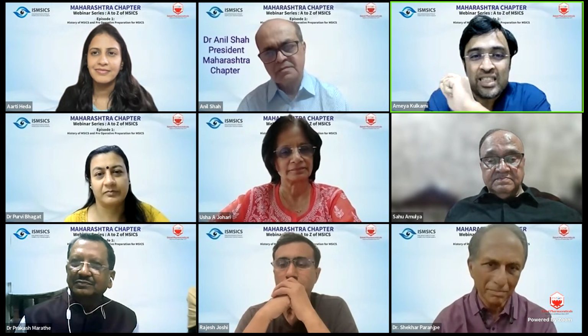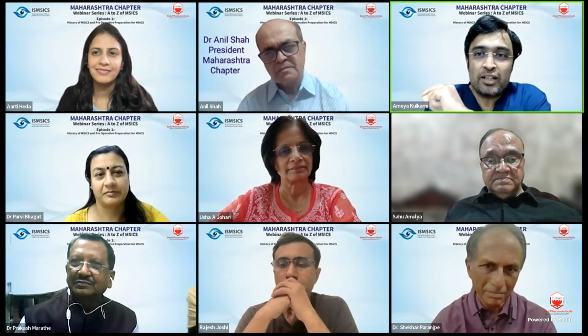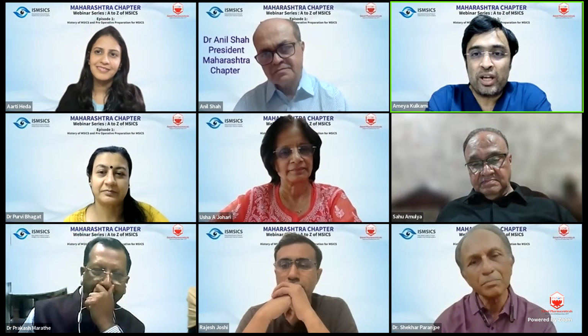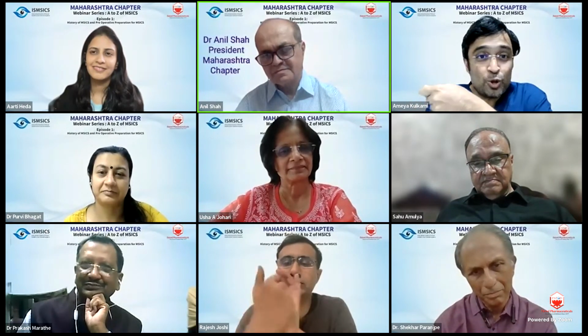I've seen Bhayasaheb's ECC being completely astigmatically neutral after taking 5 sutures. We've seen him putting those lenses and suturing so well that there used to be absolutely no astigmatism in an ECC patient. And there were no A scans. When he started putting IOLs, there were no A scans. So intraoperatively, he used to actually take a retinoscope, do retinoscopy, and then put a lens. So there never used to be many refractive surprises post-op. Fantastic, phenomenal skill set.